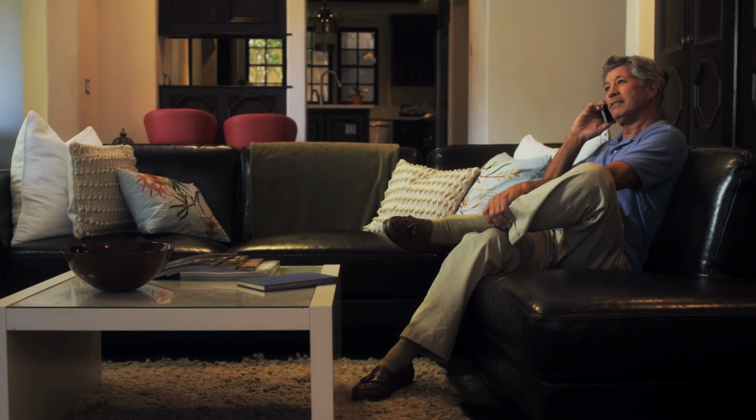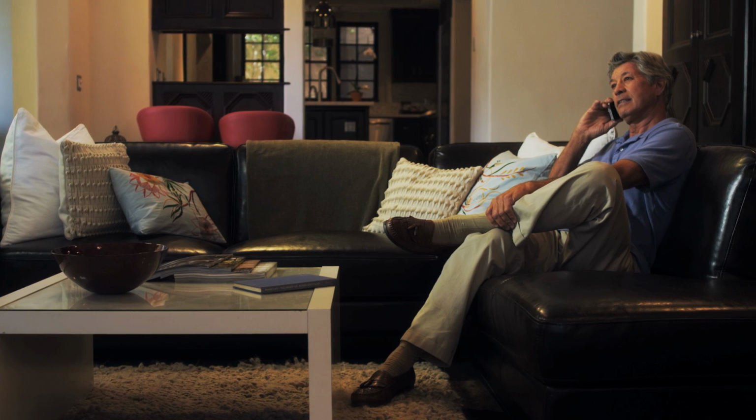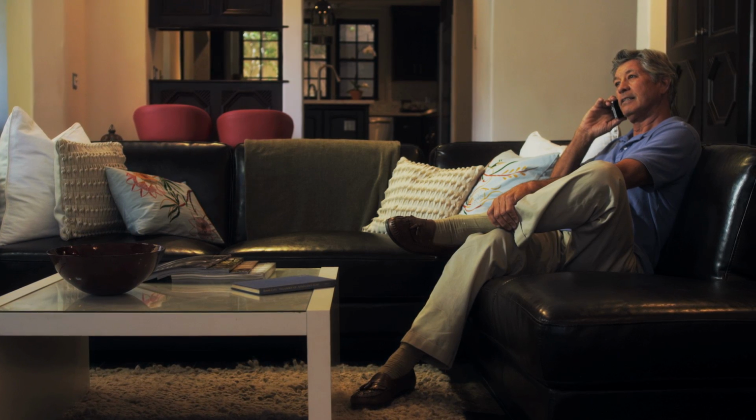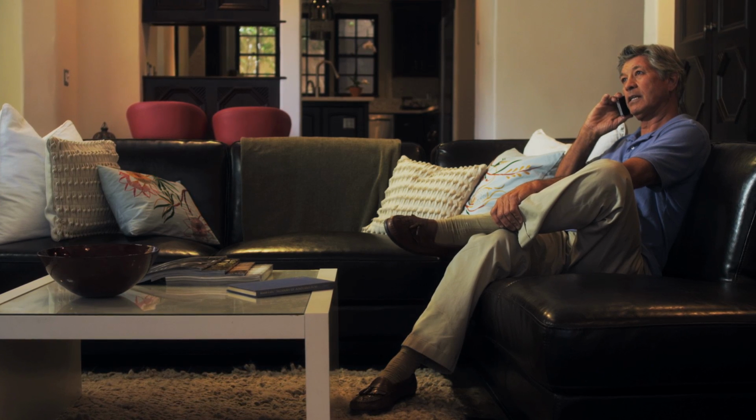Recharging your stimulator battery is similar to recharging your cell phone. If you're making calls all day long, you'll have to recharge it more often. But if you only use it a couple of times throughout the day, that same charge will last much longer.